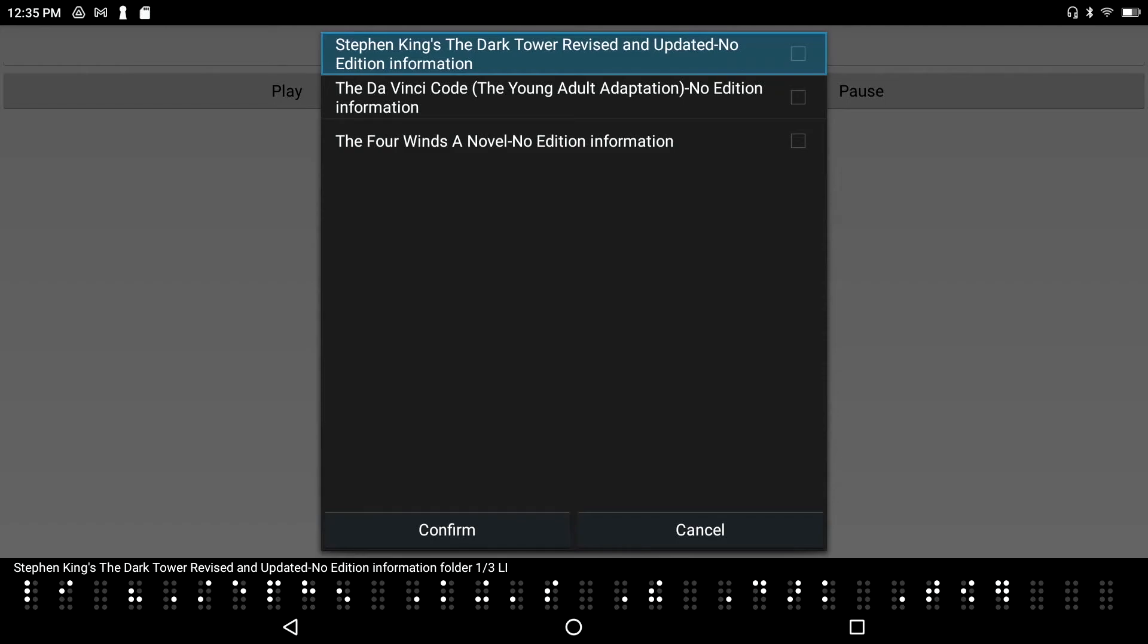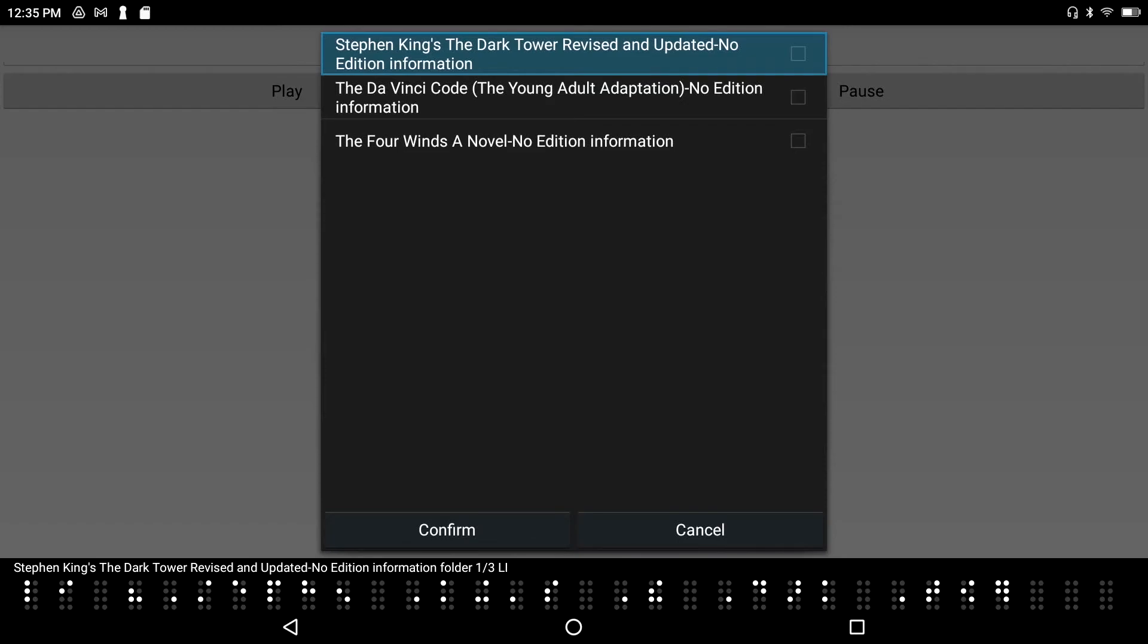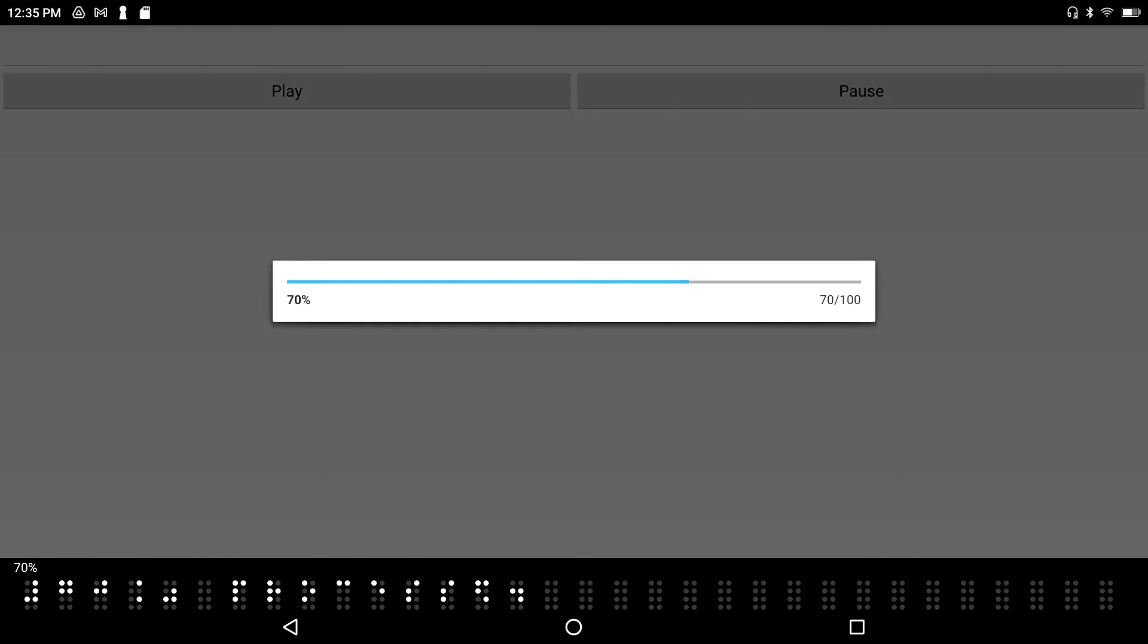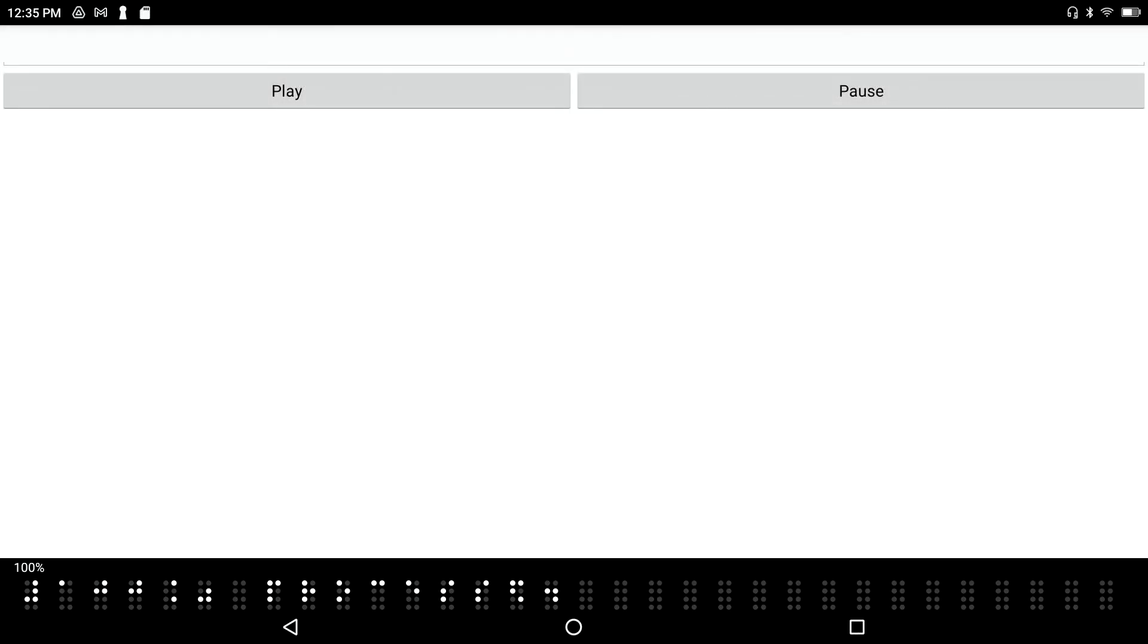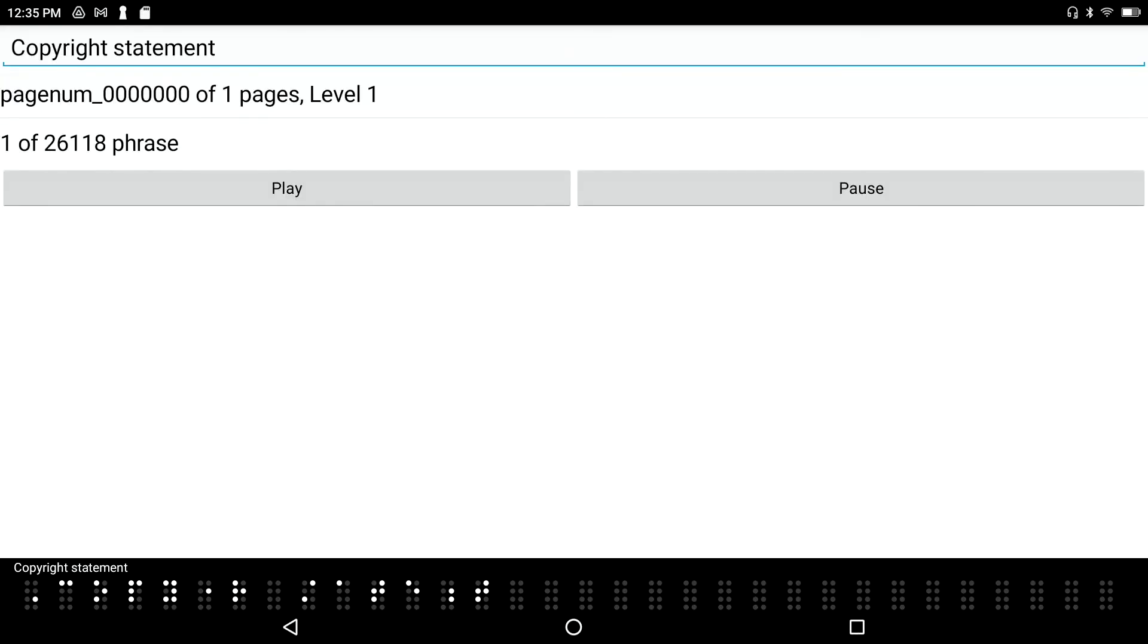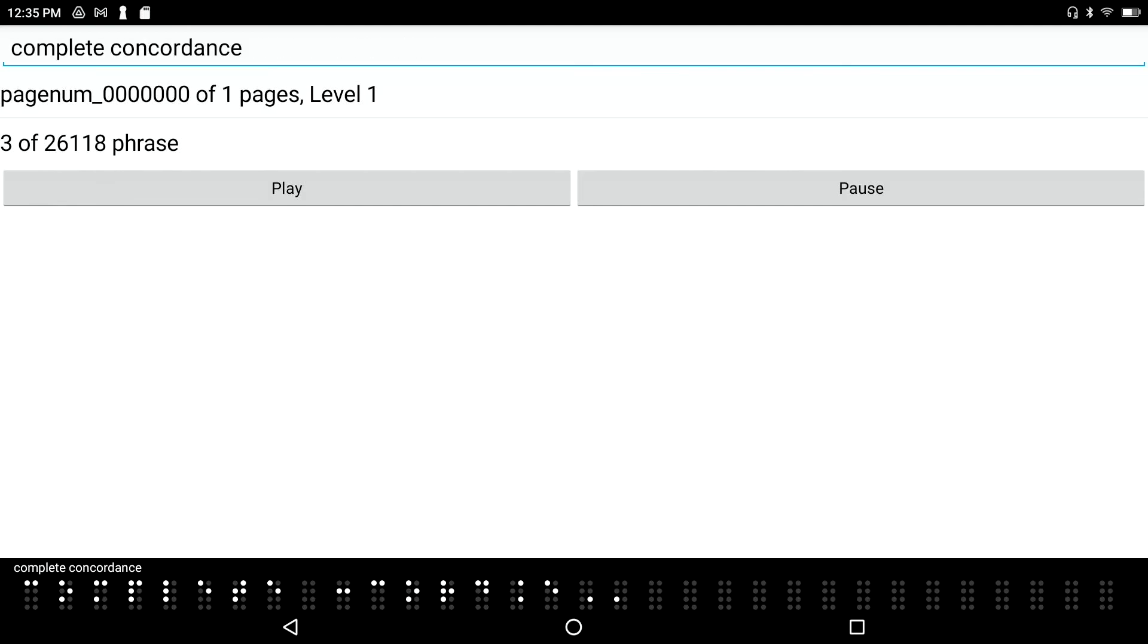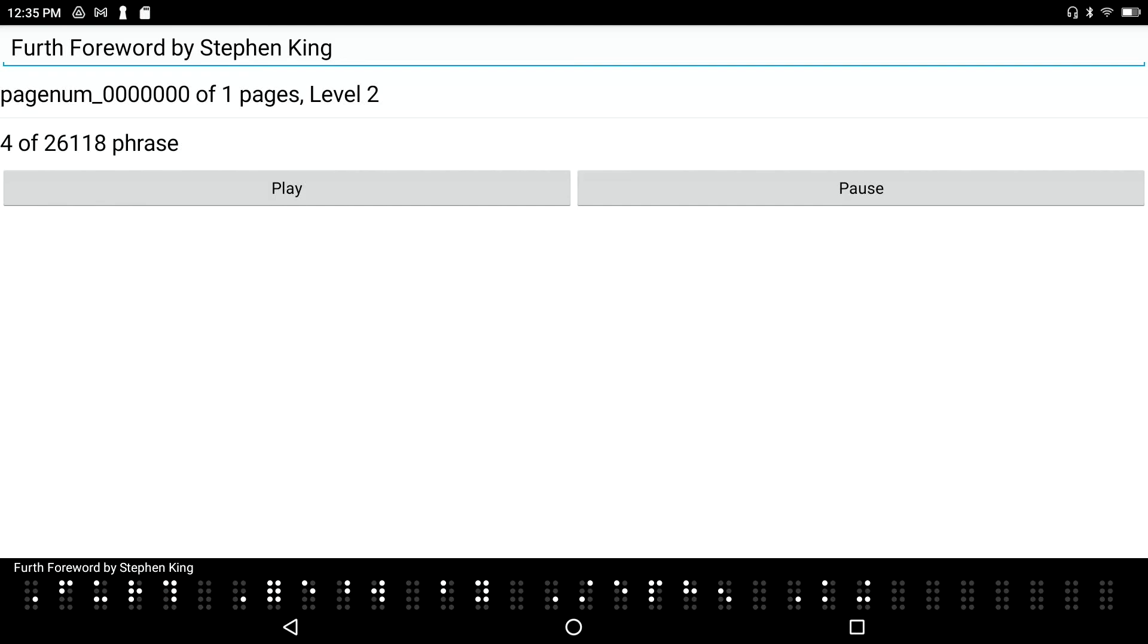Open Daisy: Stephen King's The Dark Tower Revised and Updated. I've got a few books in here and the first one happens to be the one I just downloaded. To select this book, I press space on it. Selected: Stephen King's The Dark Tower Revised and Updated. I'll press enter. Stephen King copyright statement. Stephen King's The Dark Tower: The Complete Concordance Revised and Updated by Robin Firth, forward by Stephen King.